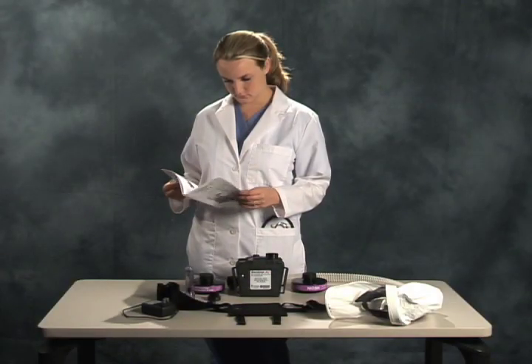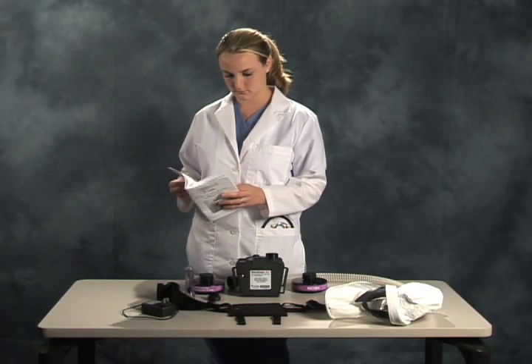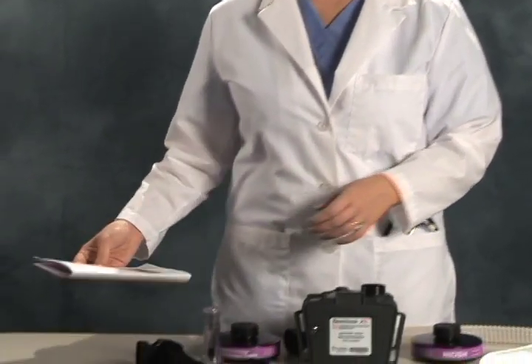Prior to using the Sentinel HP, review the instruction manual thoroughly. In addition, please consult your Hospital Occupational Health and Safety Director concerning the proper use of any additional protective equipment that may be necessary.